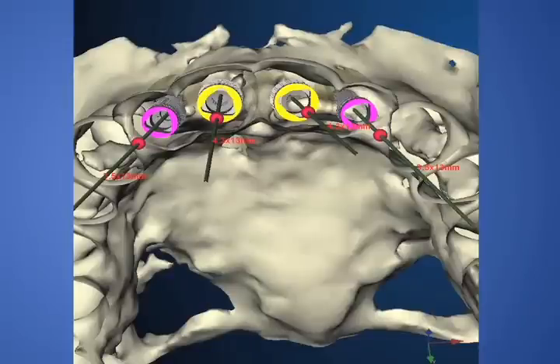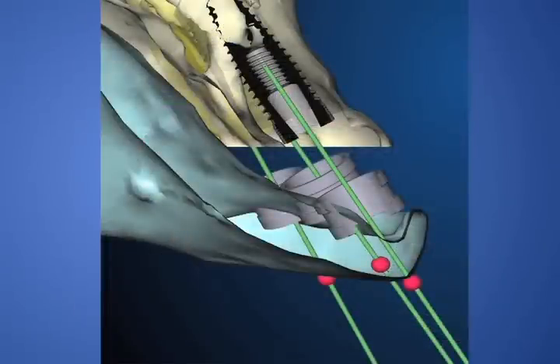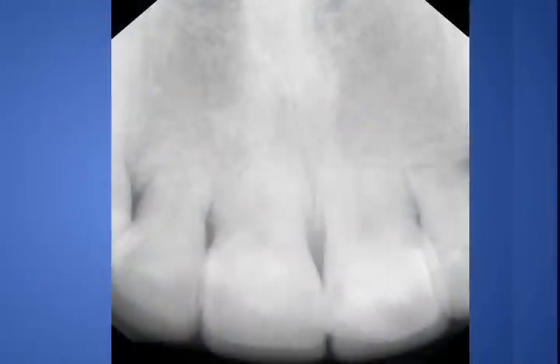However, Nobel Guide tells us that placing implants in immediate extraction sites is a difficult, if not challenging, endeavor. We knew preoperatively that the roots of the teeth had resorbed significantly, so we felt we would be obliterating the sockets completely in the placement of the dental implants.